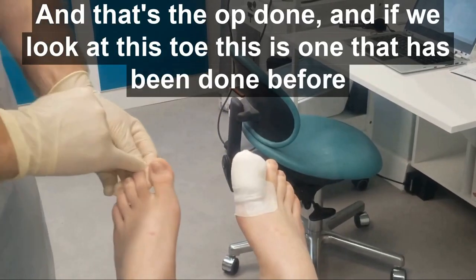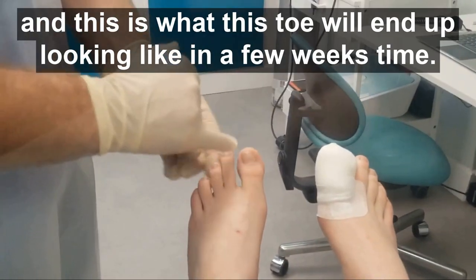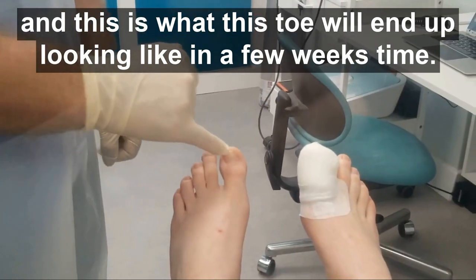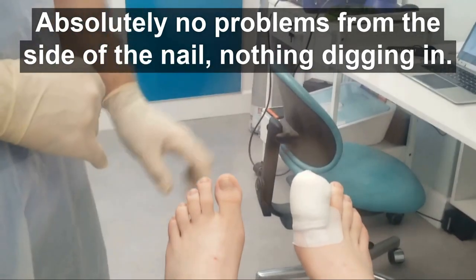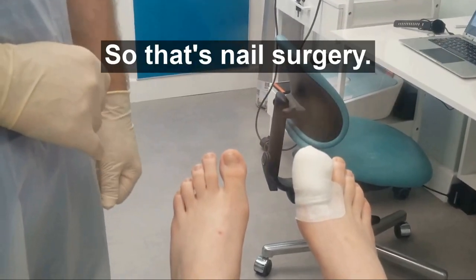And that's the op done. If we look at this toe — this is one that's been done before — this is what this toe will end up looking like in a few weeks' time: absolutely no problems from the side of the nail, nothing digging in, making you completely comfortable. So that's nail surgery.